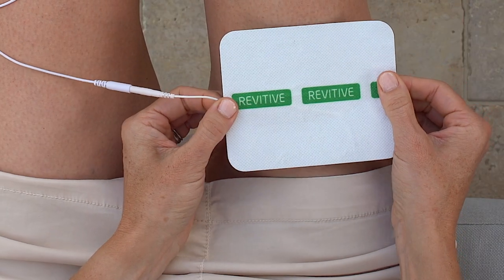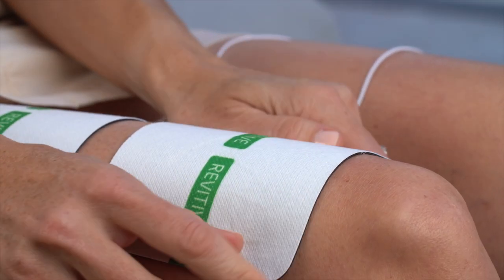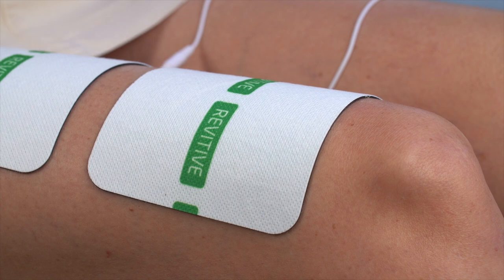Press one of the arthritis pads across the very top of your thigh, then gently press the second arthritis pad across the bottom of your thigh, a few centimeters above the knee.